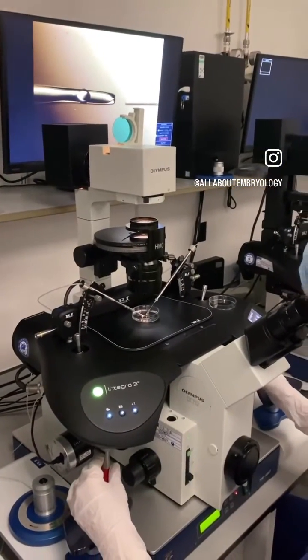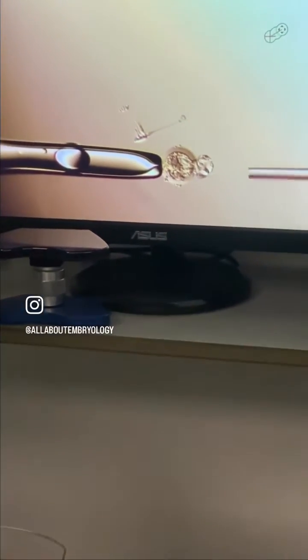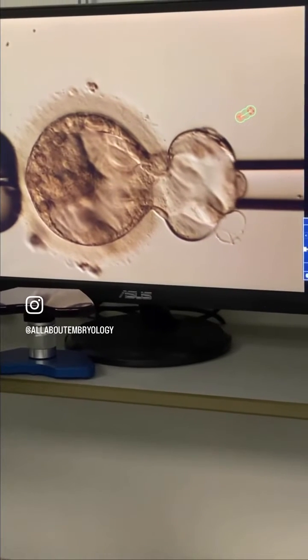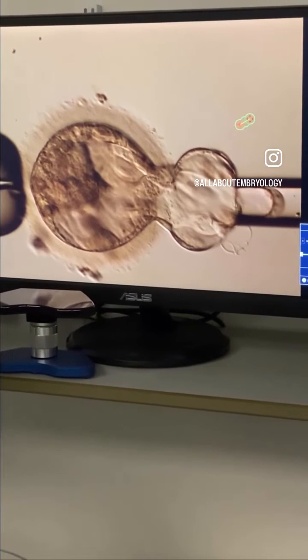Once the pipettes are aligned and primed and the blastocyst is in position, it can then be secured onto the holding pipette. Then the embryologist applies suction to the outer herniating cells using the biopsy pipette.